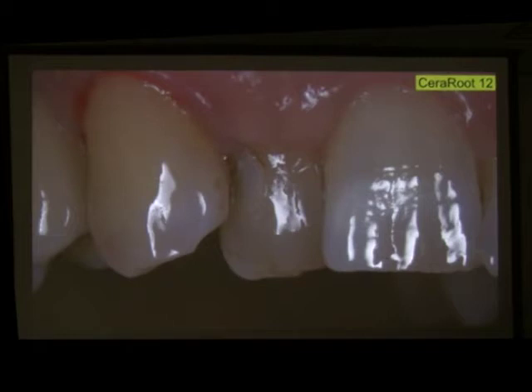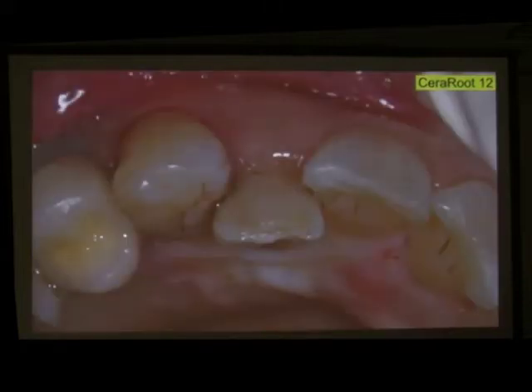We try to do, of course, no retreatments of root canals, and patients that are not sure what type of treatment is better, root canal or implant, we always tell them that an implant does not absorb any type of liquid or bacteria, and the implant will not suffer damage over time, whereas the tooth, for sure, due to the age of the patient, will be extracted sooner or later.